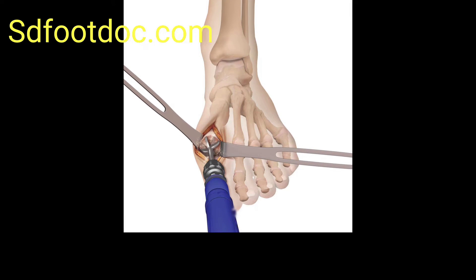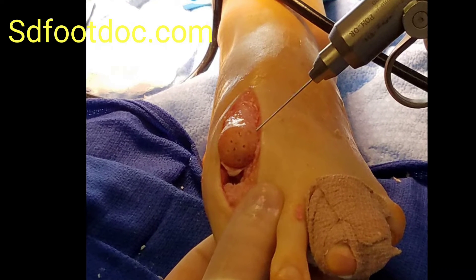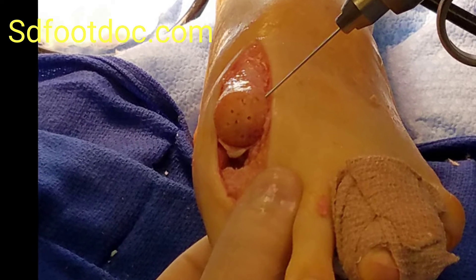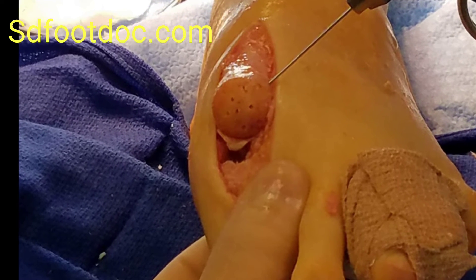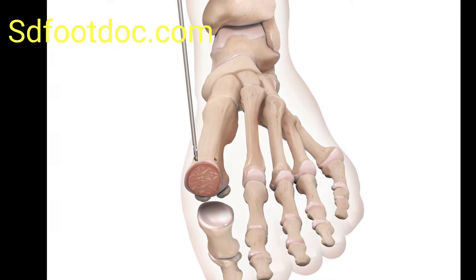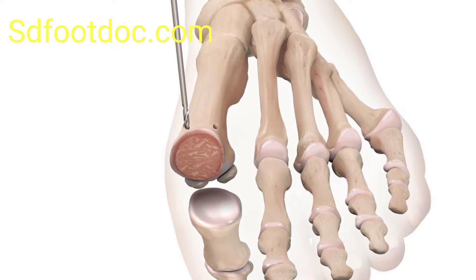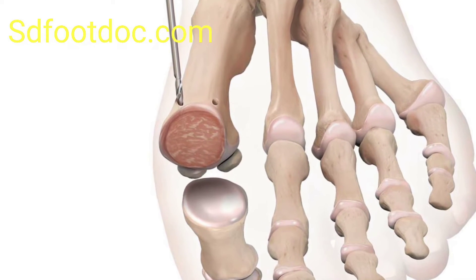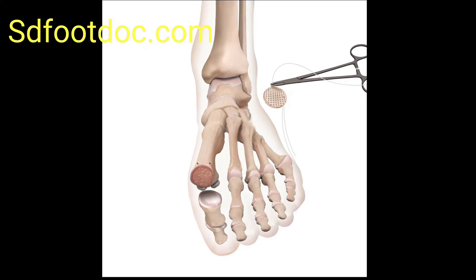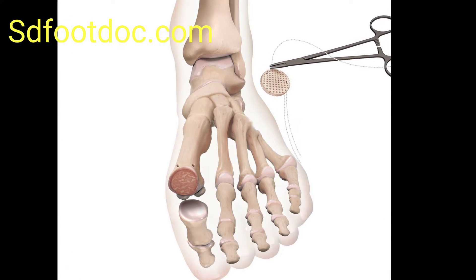There's an intact cartilage structure and a small bony portion of cartiform that's pushed onto the graft, which allows it to stick to the portion of bone that we expose once we clean off the diseased cartilage. The cartiform combines the safety and success of fresh osteochondral allografts with ease of use, because you can trim it and it's flexible to any type of size and lesion.